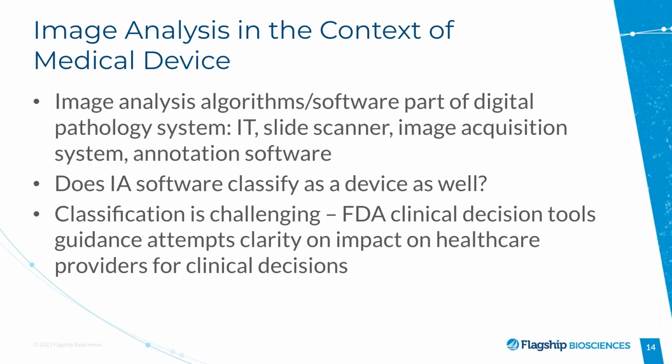Right. So essentially, in terms of regulatory perspective, one thing to keep in mind is that once you transfer a wet assay to a digital assay, a digital solution, you essentially create a new assay. So all the traditional steps that pathologists are very familiar with, validation, quality control, and the regulatory aspects of the traditional assay are still true, with the notable change that now the degree of complexity has actually grown.